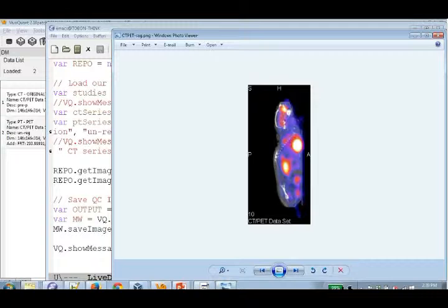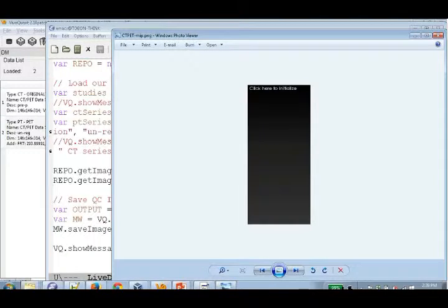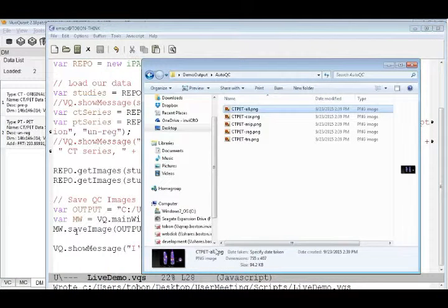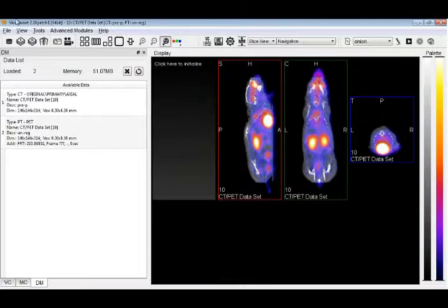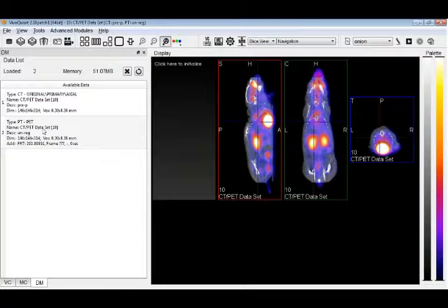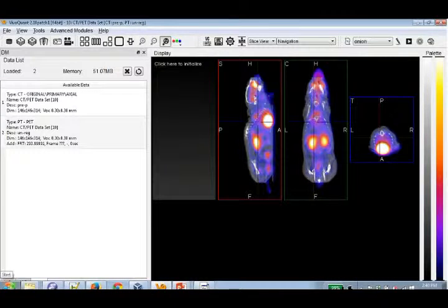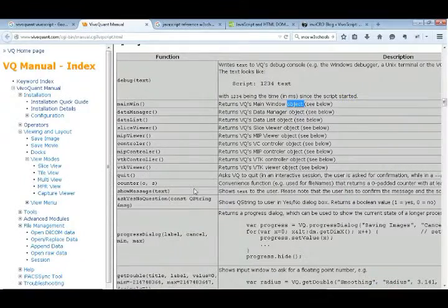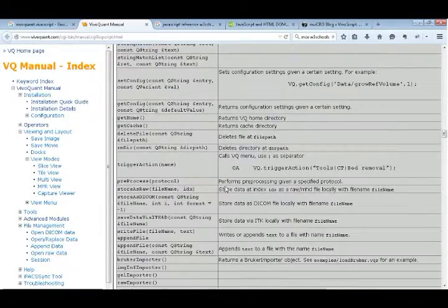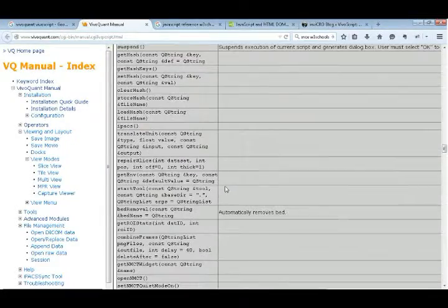Obviously, we had some other step before that enabled the MIP viewer. And you know what, I'm going to make my life a little harder as well by making the options different. Because let's say you want to give this script to your friend later. Well, your friend has the crosshair on but didn't have the patient name on, and he's in the VTK viewer. So now, how do I get my settings to match exactly what I did before? Generally, these settings are also located in mainWin, for functions here.